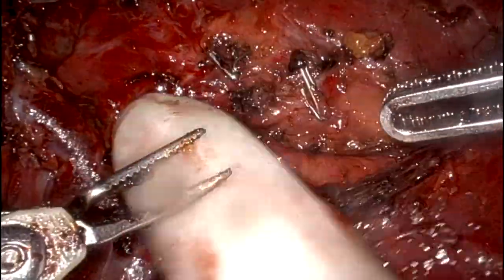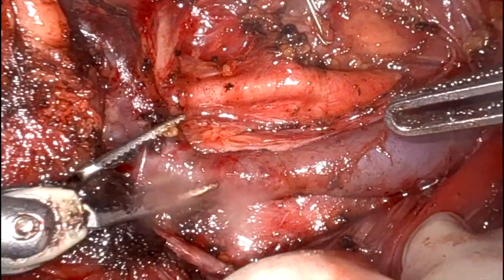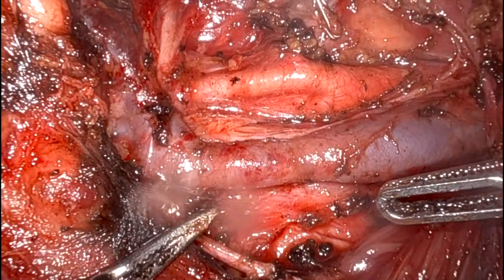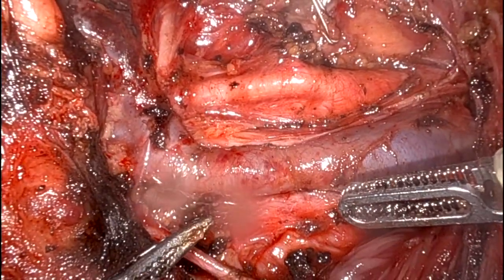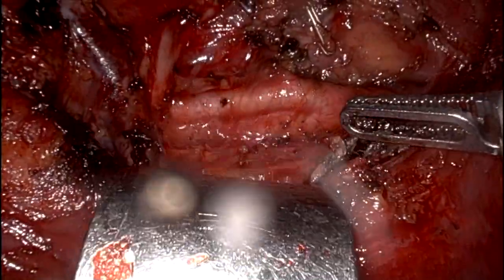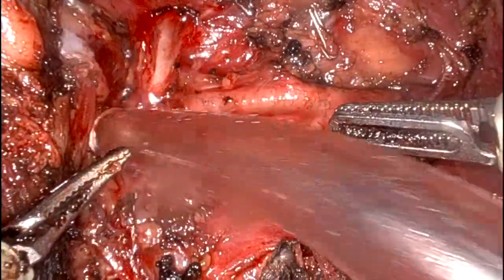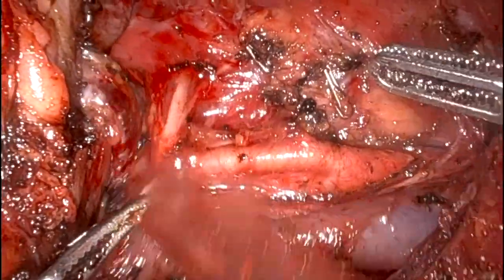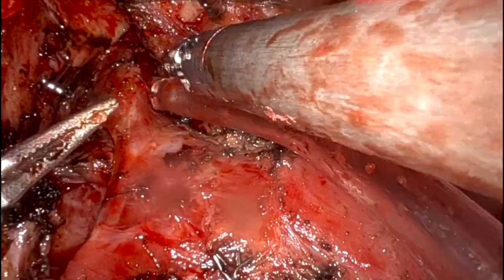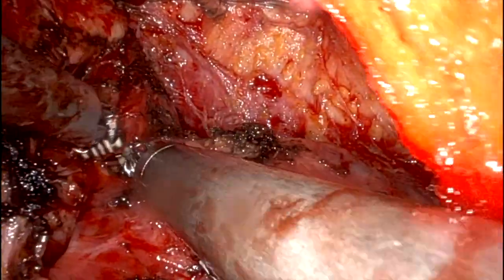This is how we check for bleeding. So no oozing, no bleeding. The field is absolutely clean and clear. So we check for bleeding. This is the level 1B area. This is the anterior belly of the digastric muscle. This is 1A. No bleeding.